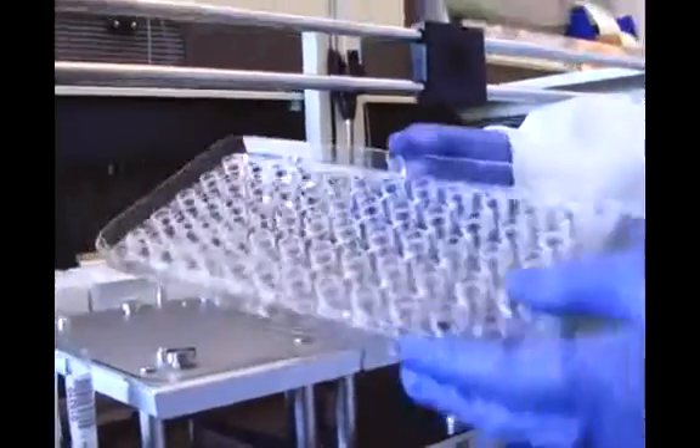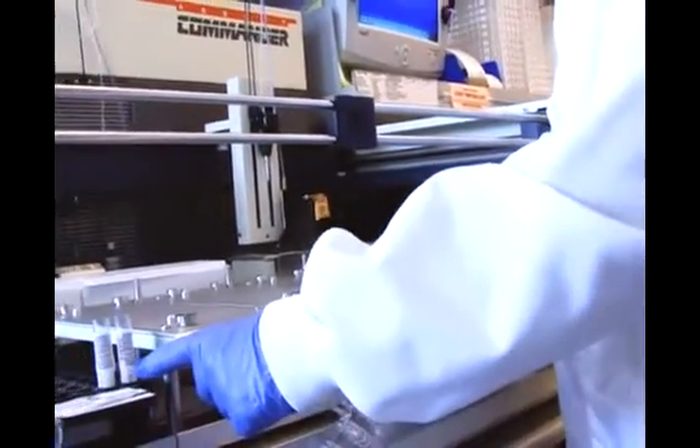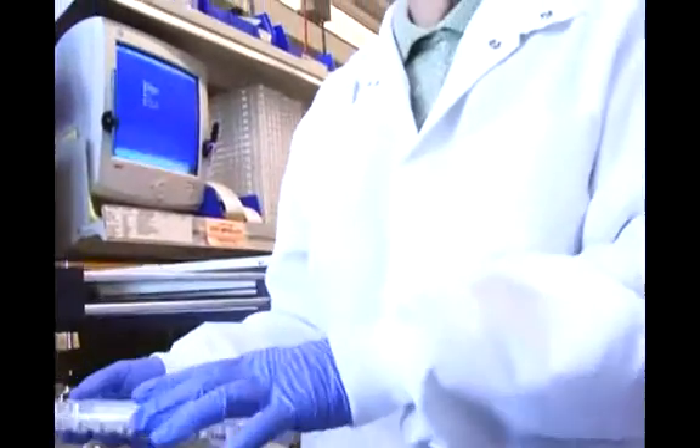Notice that everything here has a barcode — there's a barcode on the source rack and a barcode on the actual donor sample. So the software is going to always link the donor sample to the tray and where it went into the actual tray.